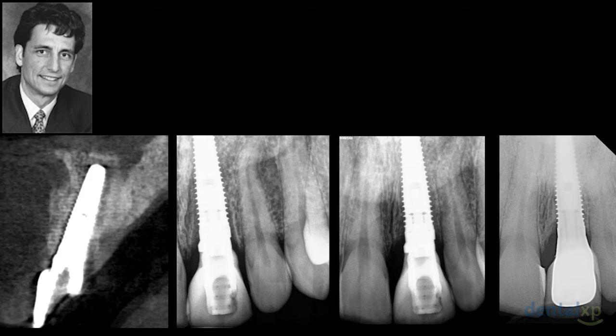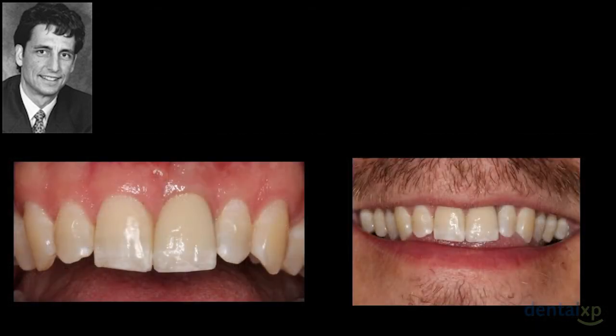Do you go back in, do supplemental grafting? Do you discuss it with the patient? We've done it both ways. We've let the patient make that decision. But if you've not taken the CT scan, your two-dimensional film is not going to give you that information.